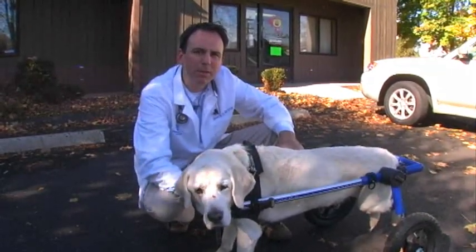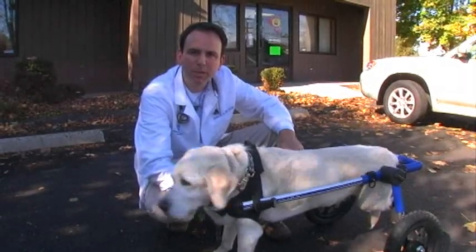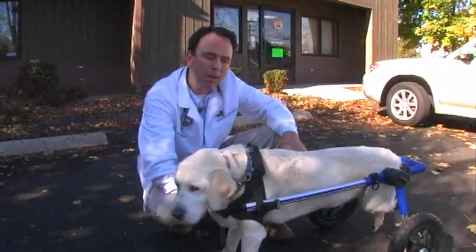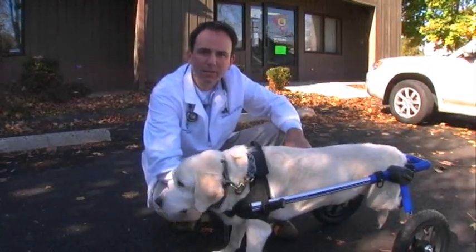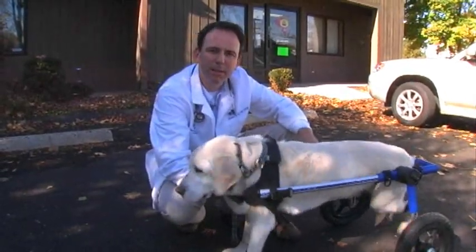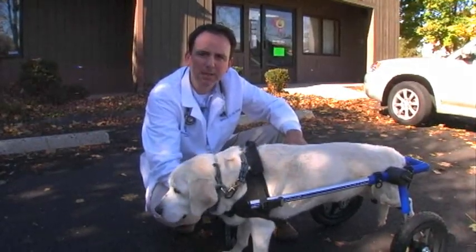Another thing you really want to focus on is positive reinforcement. It's just like when Sonny was a puppy and we wanted him to go to the bathroom outside, we would give him treats and a lot of love and happy dances. We want to do the same thing with the cart. We want to make sure that the dog has the perception that it's a positive experience.